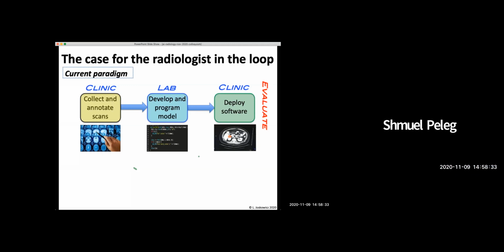So you're going to need the radiologist, but it's going to be done in an optimized fashion. You mentioned that the radiologists in normal life basically issue a written report. They don't actually mark anything. So why don't we train the neural network to produce this written report? Why go through an intermediate stage?